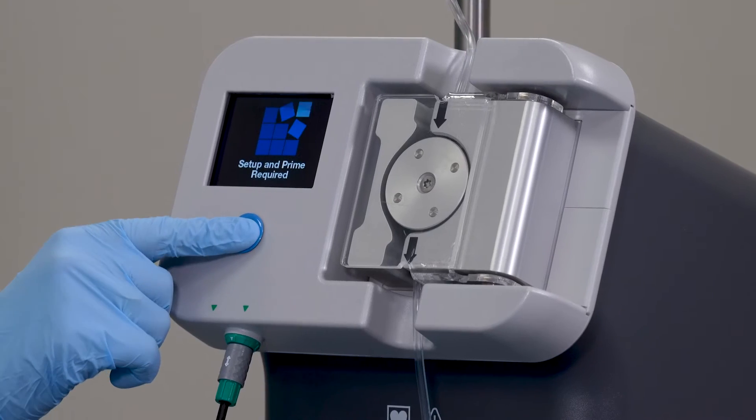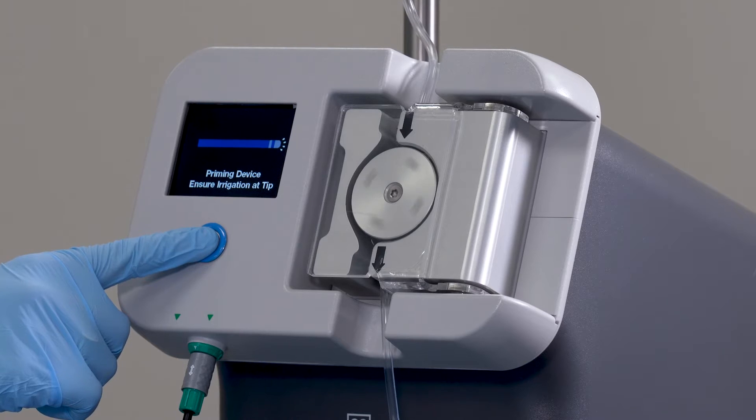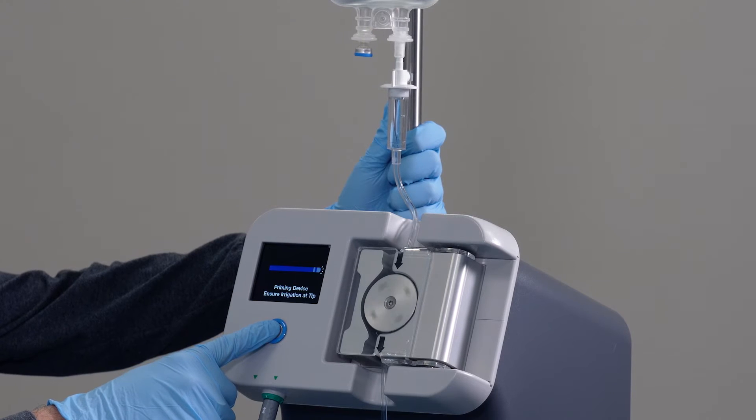Press the flush button on the console until constant flow is observed at the Crosser IQ Ultrasonic CTO device tip. The LCD screen will show: priming device, ensure irrigation at tip. It is important to inspect the saline line for bubbles. If bubbles are observed, press the flush button again until bubbles are eradicated.